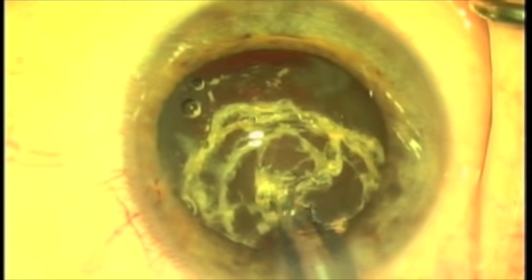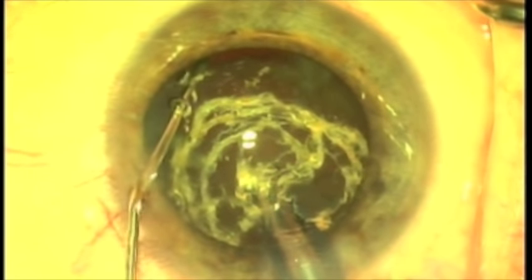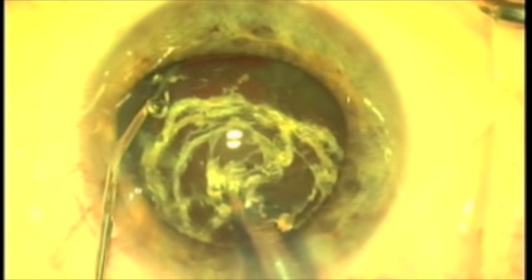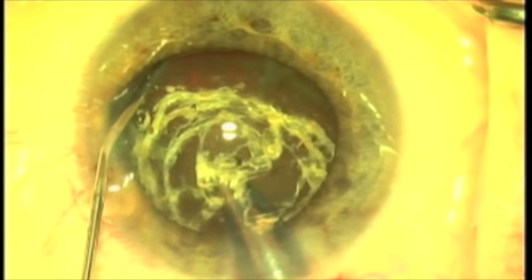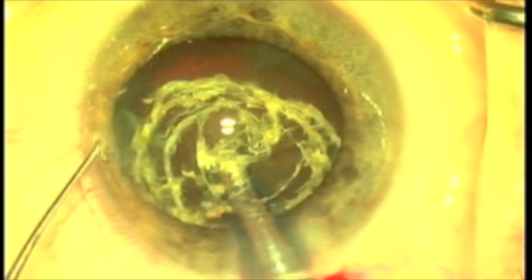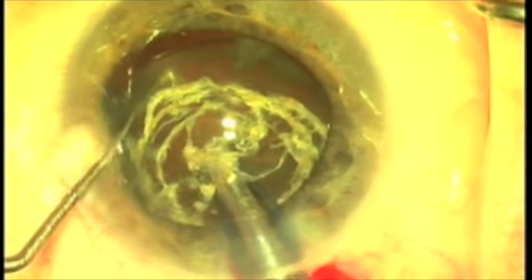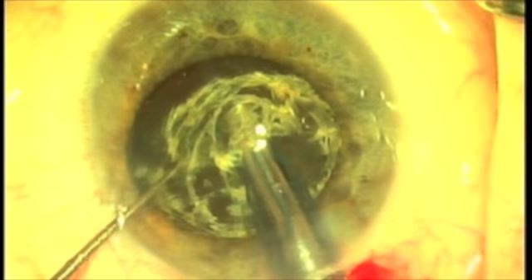The phaco tip goes in and impales the nucleus. We pull the nucleus out of the lens bag, and here with the left hand I'm injecting viscoelastic behind this nucleus in order to push the capsule back out of the field of action and actually hold the nucleus up in the iris plane.